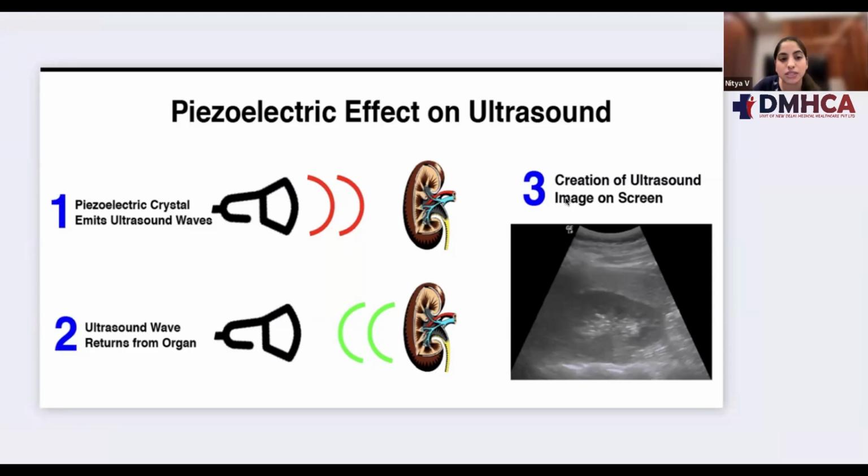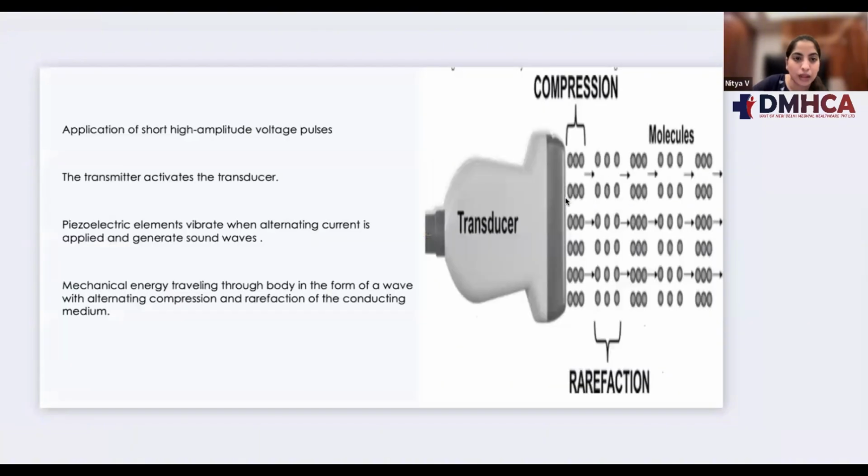When the piezoelectric crystals get activated, they emit sound waves, and these sound waves hit the organ, which reflects them back into the ultrasound probe, and that creates an image on the screen.